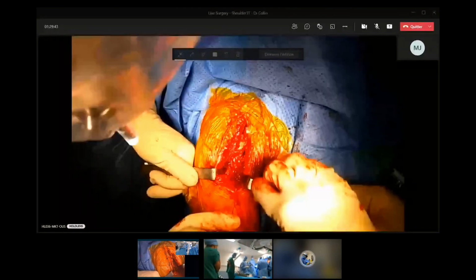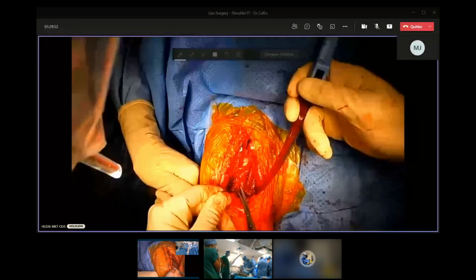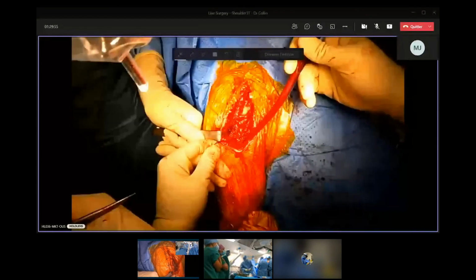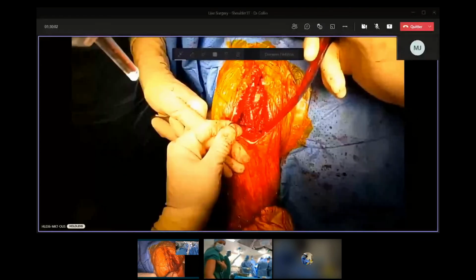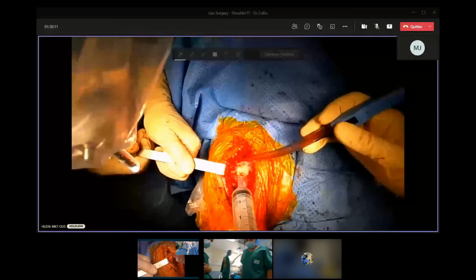So now we're going to wash. Ciseaux. C'est pas ces ciseaux-là, c'est des ciseaux de maillot. Okay, can we wash? Okay, section. So I think it's finished.